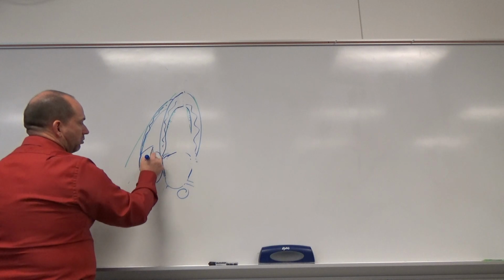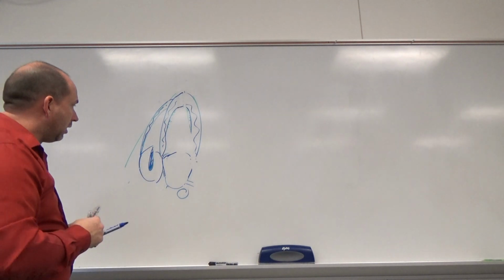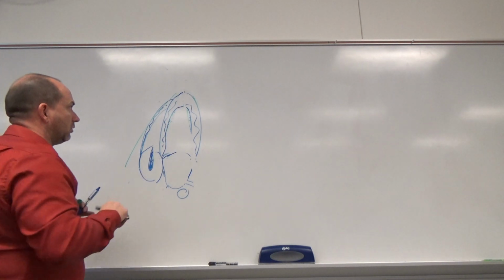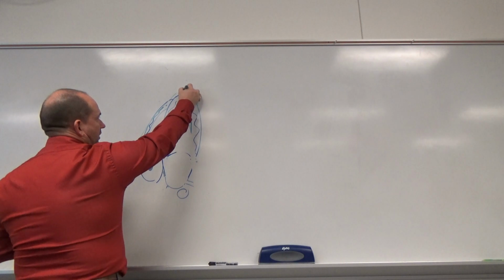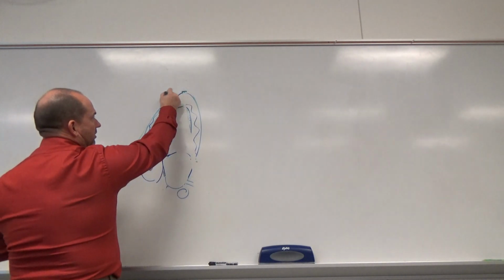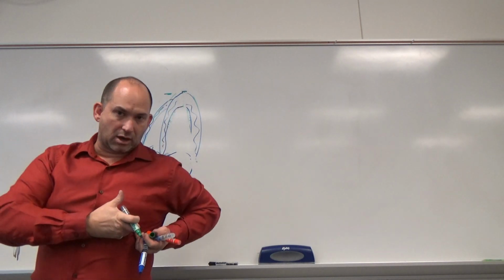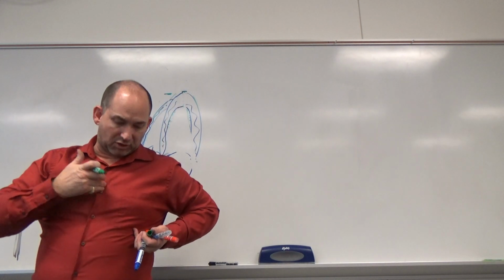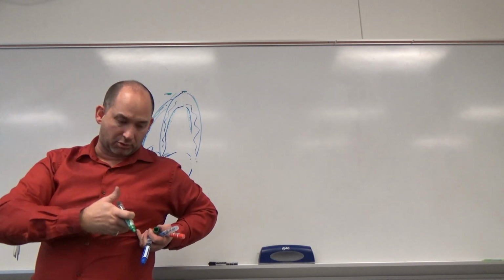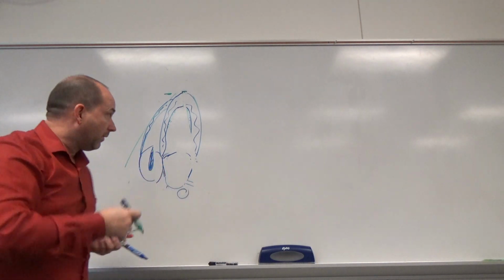The leak will also be in blue. This is the best angle that we can possibly get. But to get this, we do what's called a modified apical view, meaning that we bring the transducer from the peak of the apex of the LV to being over the peak of the apex of the RV. To do that, you're actually going to come a little bit more between the parasternal views and the apical views. So you're going to come partway between to be right over top of the right ventricle.